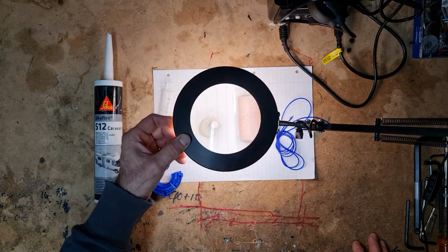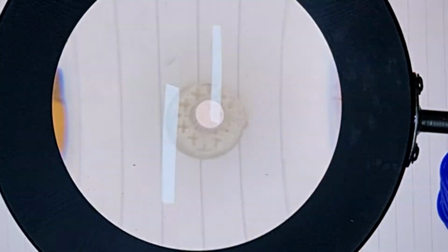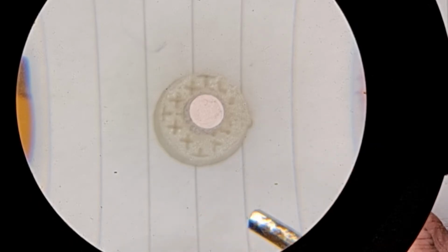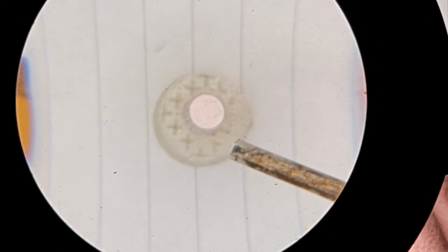We'll just go right up to that and have a look. Just make sure I've got it in the right position. Okay, we'll have a quick look at that in detail. I'm going to switch the lights off just so we don't get any reflection. There we go. Okay, so what we've got there is my outer suspension system, which is basically I'm trying to get it to act like a coil spring. So I've tried various different methods to give that a kind of a coiled response. So you can see there, that's one of the types of infill that I've tried.